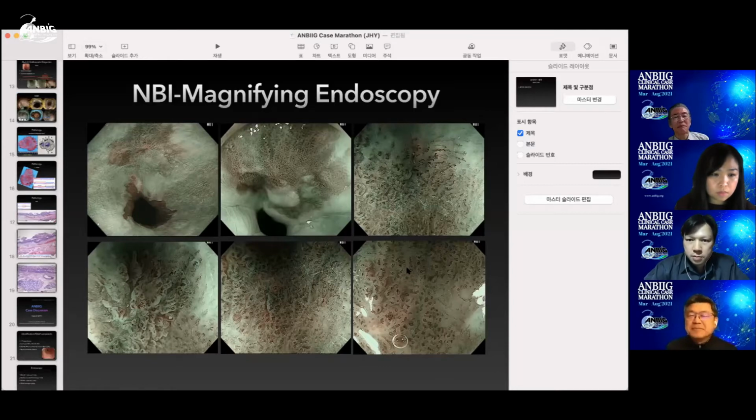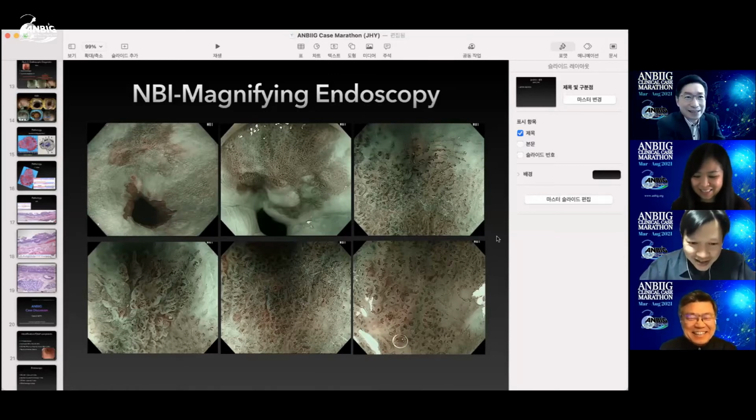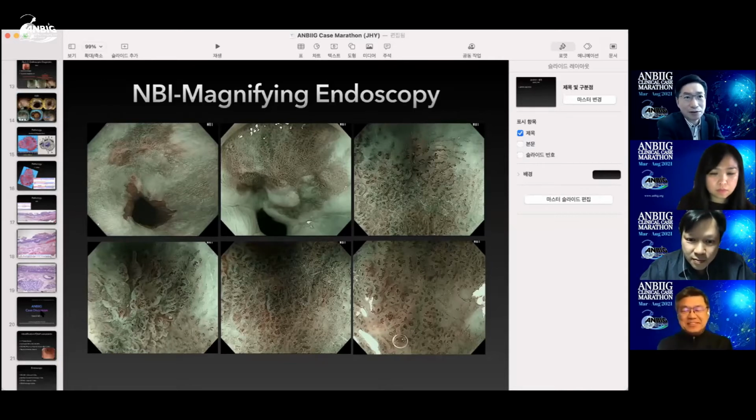Qingtai, do you have any other comment? Sorry, I'm busy answering the question about my topic. Just to follow up on the pathology: interestingly, there's some pseudo-granular appearance of the background. Could that actually be related to the HPV virus, a papillomatous kind of appearance? I don't know, just a follow-up proposal. But very nice case, a really good demonstration.